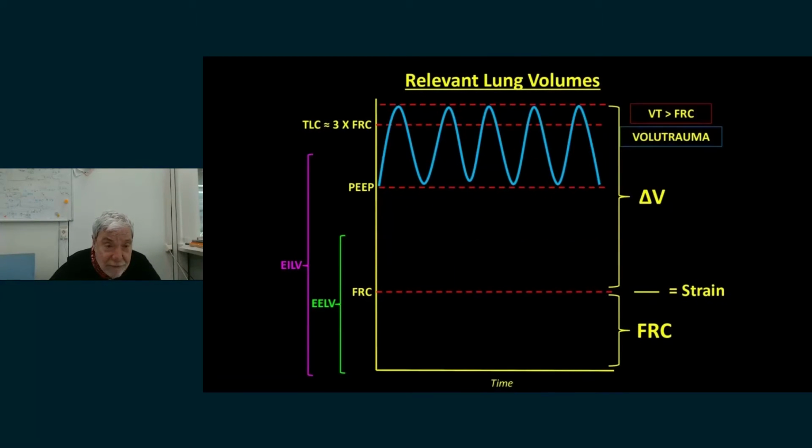And of course, when I have a further increase of PEEP at each tidal volume, my risk is to overcome the physical limit of the lung. Now, you are hearing me at this moment. Try to take the deepest breath you can. You are at total lung capacity.